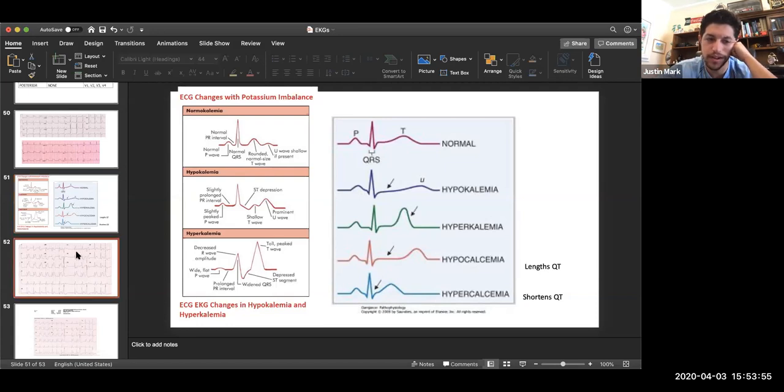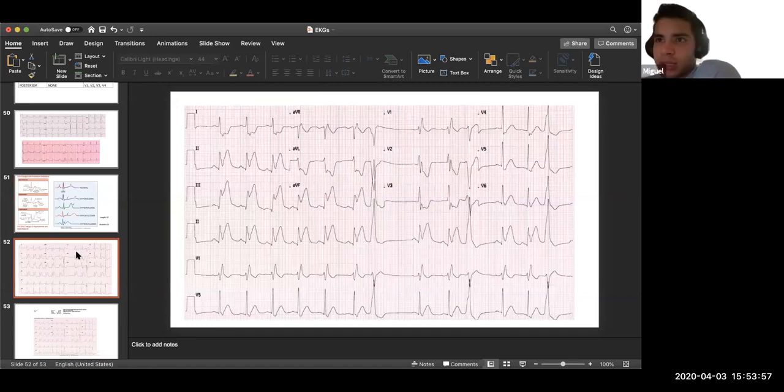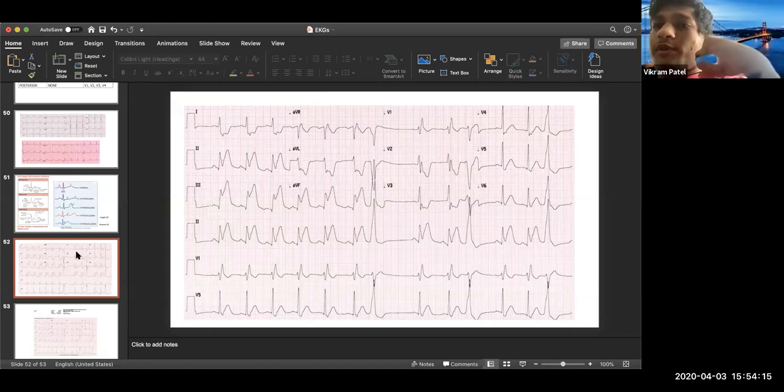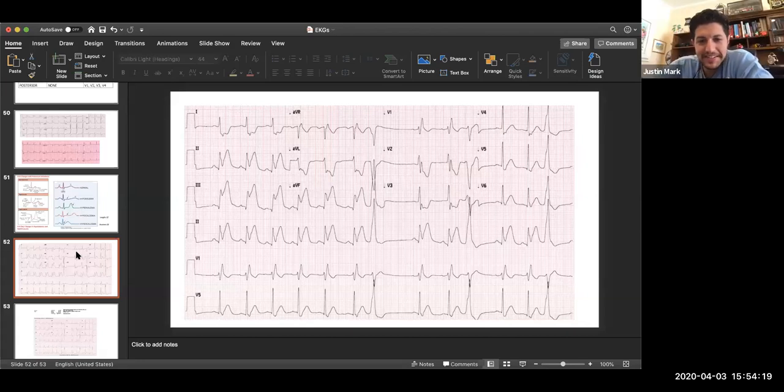You guys ready for the final exam? Man. So we got that. Holy shit. So tell me rate, rhythm. Yo, this thing rate is normal, right? My eyes hurt. Yeah, that's probably the only thing, my eyes hurt.